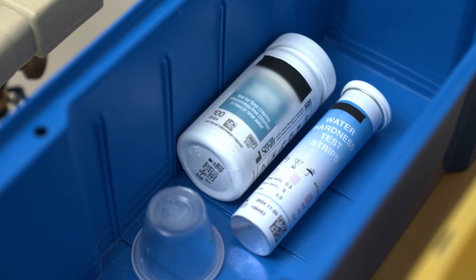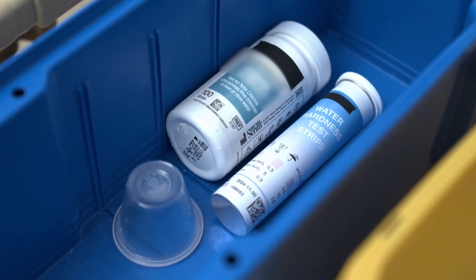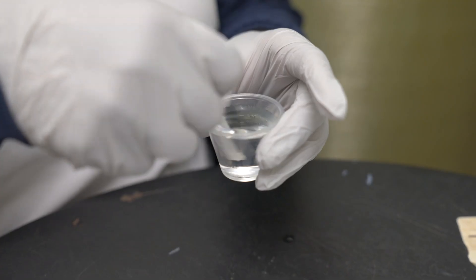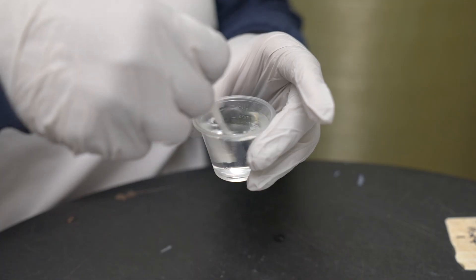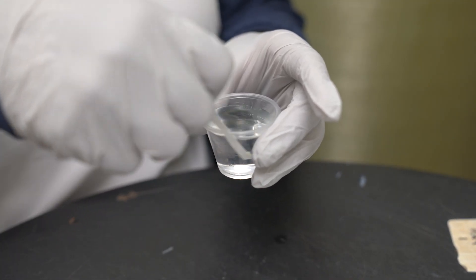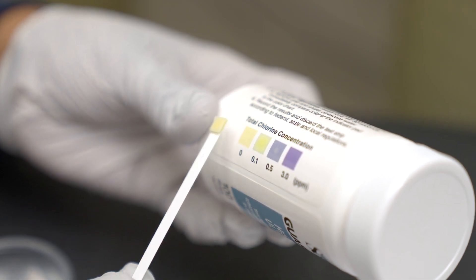Portable ROs should also be tested for chlorine and chloramine levels when in use. This test should be performed every four hours or before each treatment using a dip and read test kit. Follow the label and manufacturer's instructions for chlorine and chloramine testing, and notify appropriate personnel if results exceed 0.1 parts per million.